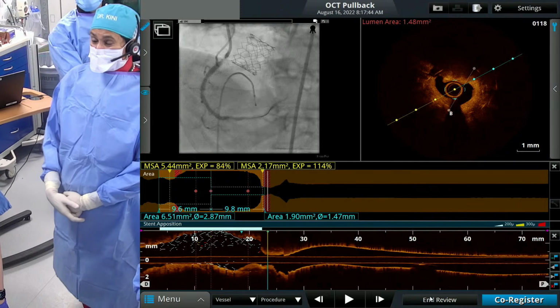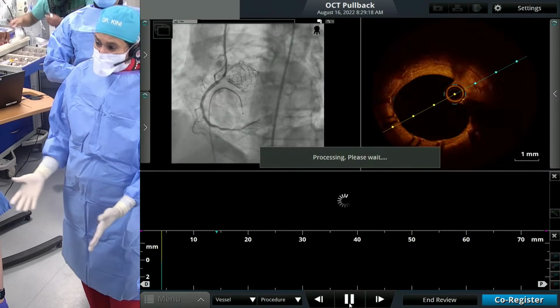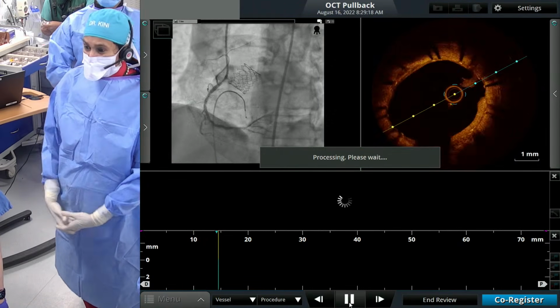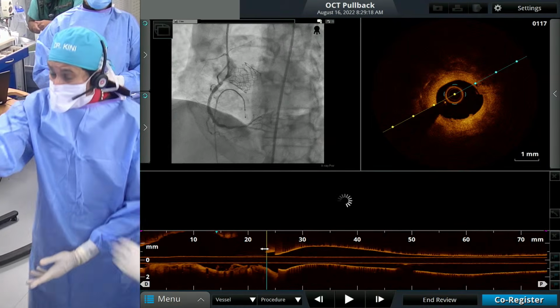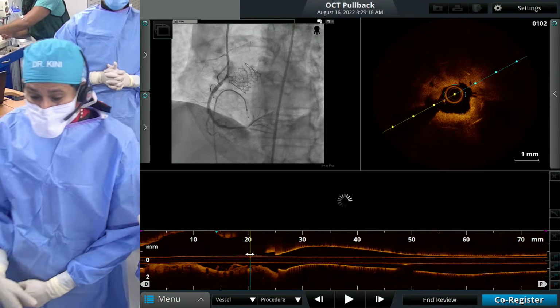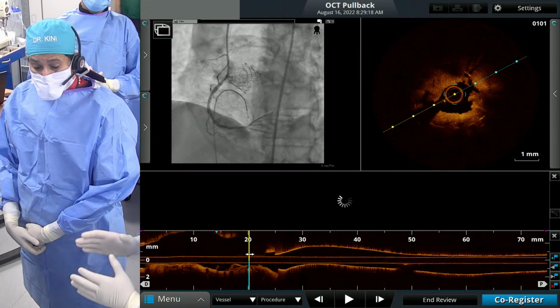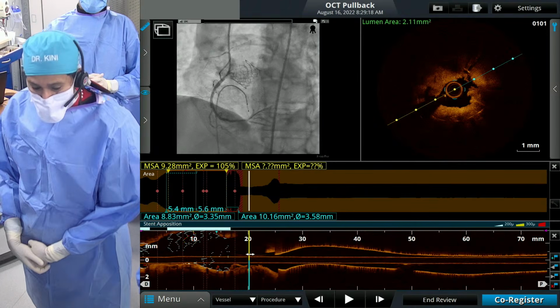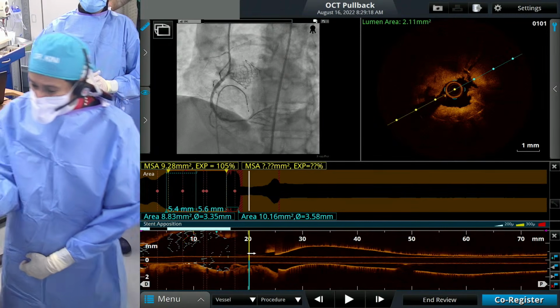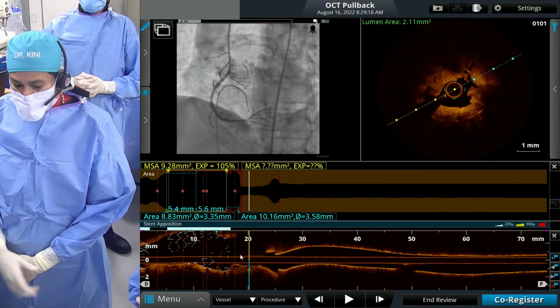So then comes, how are we going to treat? One, there's no calcium outside the stent. There's no calcium inside the stent. Now, if there is calcium inside the stent, does it mean it's neoatherosclerosis? Yes, that's also neoatherosclerosis. This is also neoatherosclerosis because we see lipid. Lipid or calcium, both are neoatherosclerosis. So this is without calcium.